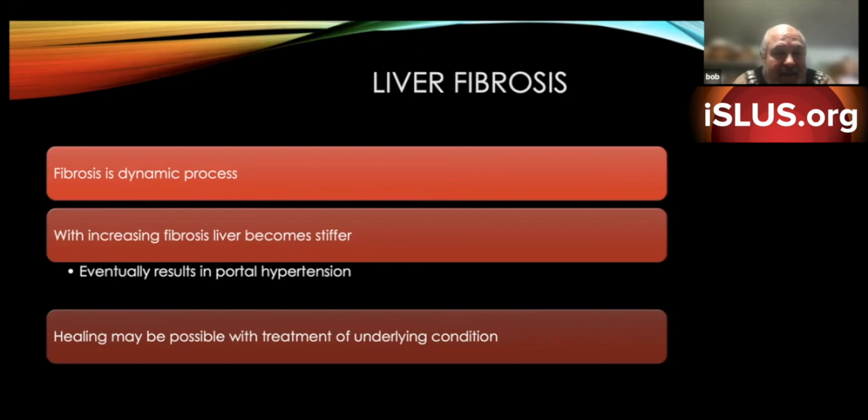So then it can't fight its way upstream through its arterial system. So it's like, here's low pressure, and I can just push my way through the portal vein back into who knows where I'm going to end up. But I got to keep moving. So it pushes the blood out of the liver. So we'll have hepatic arterial blood going into the liver and portal vein blood going out of the liver. And that's real easy to see with ultrasound.